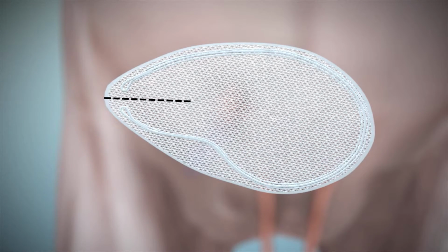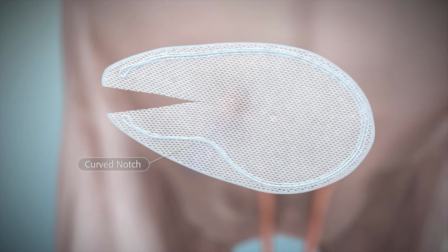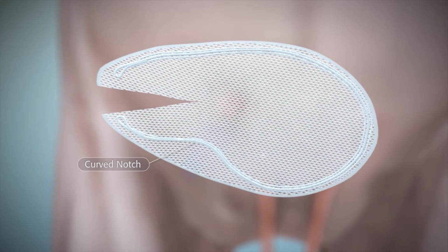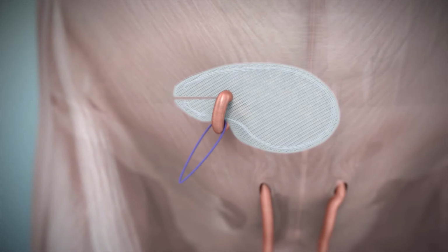Cut a horizontal slit in the Polysoft hernia patch between the interrupted ends of the memory recoil ring, down to the apex of the curved notch of the patch. Do not cut the memory recoil ring. Place the inferior tail of the Polysoft hernia patch under the spermatic cord, so that the tails are pointing lateral.